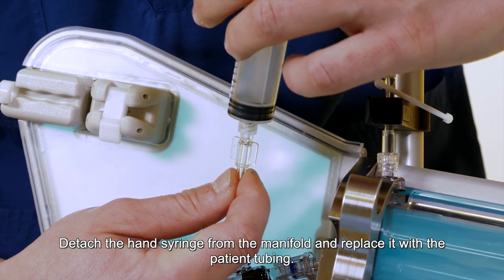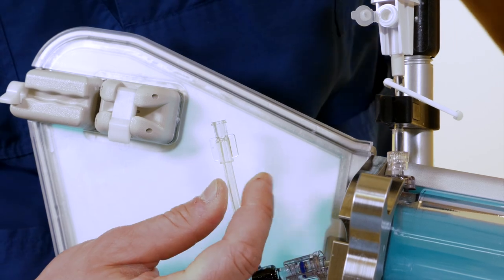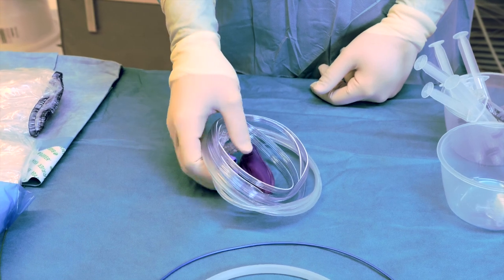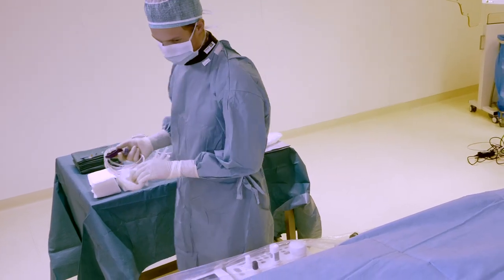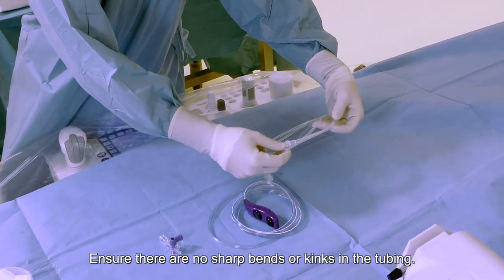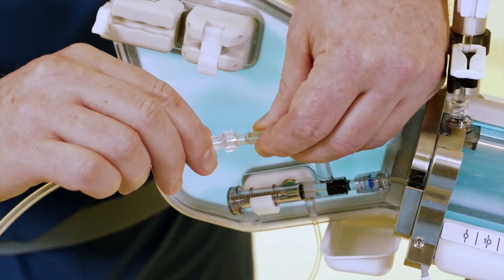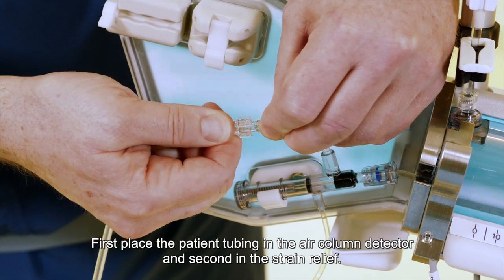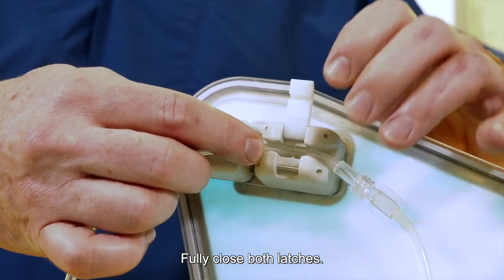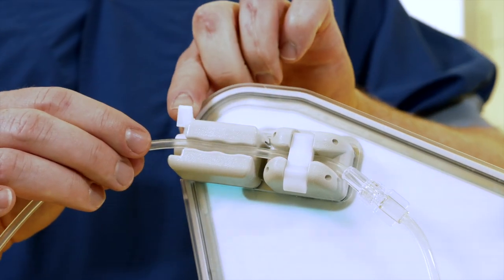Step 1. Detach the hand syringe from the manifold and replace it with the patient tubing. Ensure there are no sharp ends or kinks in the tubing. Step 2. First place the patient tubing in the air column detector and second in the strain relief. Fully close both latches. An audible click will occur when the air column detect latch is securely closed.